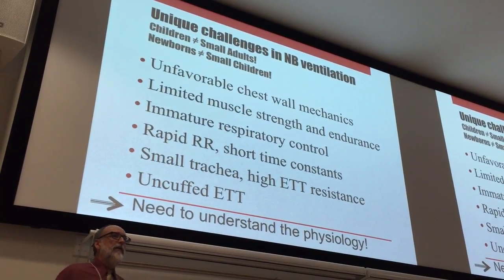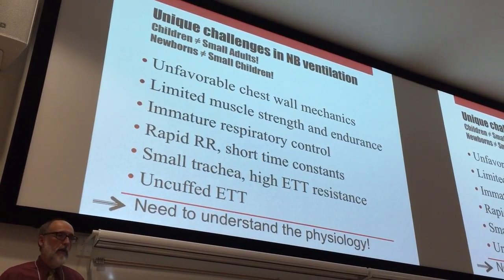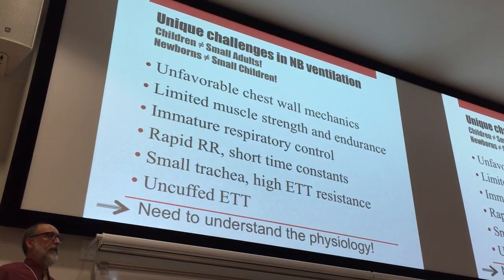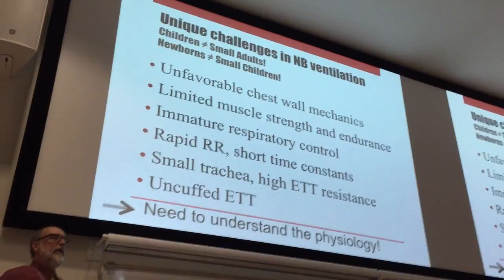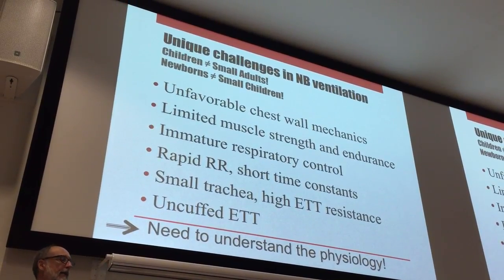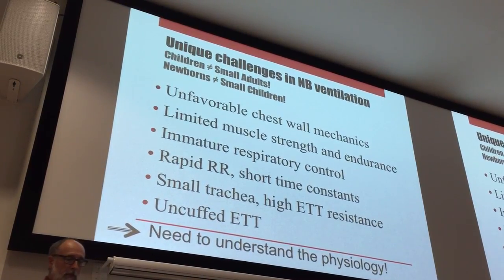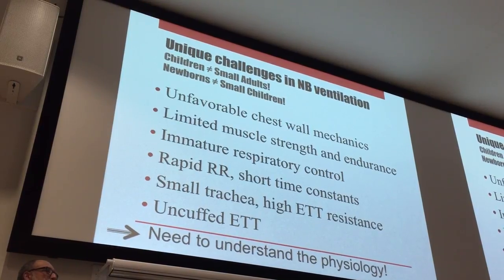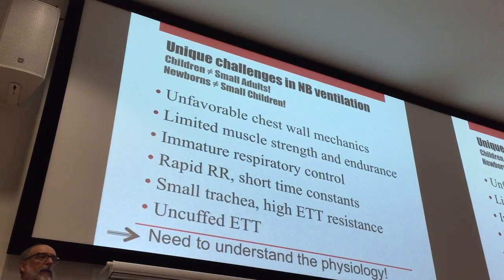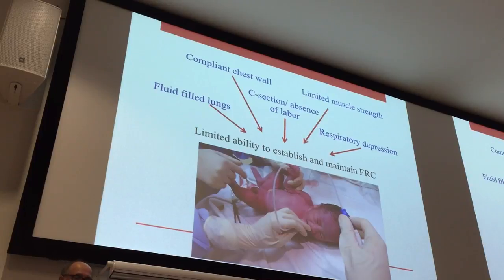And of course, we use uncuffed endotracheal tubes with frequently a significant leak around the endotracheal tube. And when we talk about tidal volume measurement and tidal volume targeting, you have to be able to measure the tidal volume accurately. And when you don't measure the tidal volume in the right place, i.e. you measure back at the ventilator, the numbers are completely fictitious. So that's a problem that we need to overcome. And devices that are not specifically designed for neonates don't do as good a job as devices that are in fact engineered to deal with some of these unique characteristics of the neonatal population.